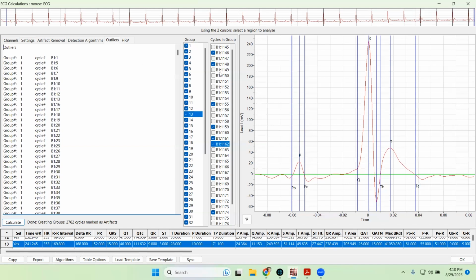We call those outliers. So if we go, for example, to 1149, we can actually find that and see that it's not checked off. It's right here, and it is not checked off. So it's considered an outlier. When we click on it, let's take a look at our ECG graph. When we click on that 1149, we can actually see where it falls. And something about that one trace, the software didn't deem actually fit with the parameters for our measurement.